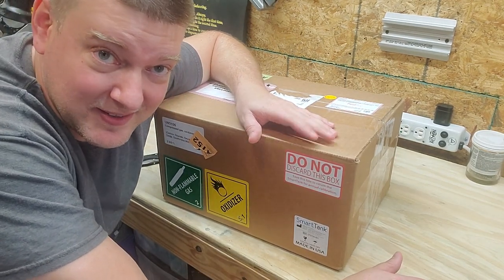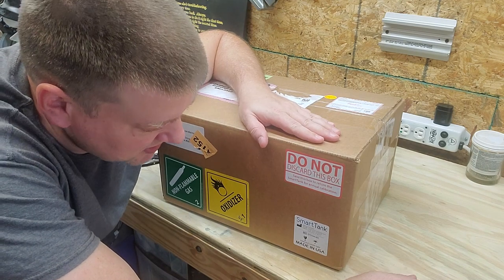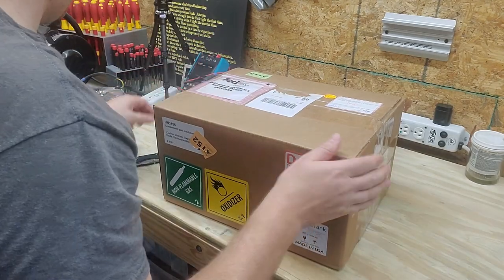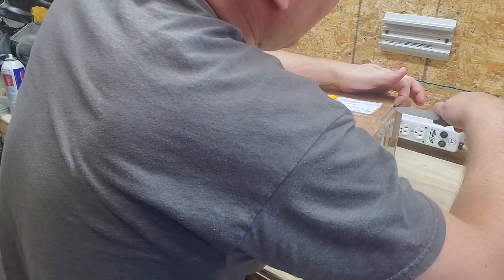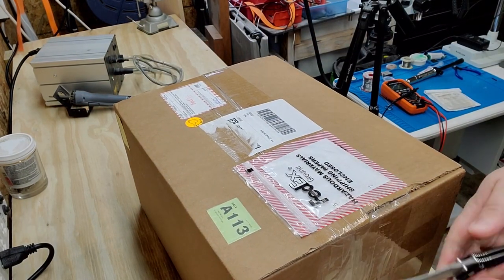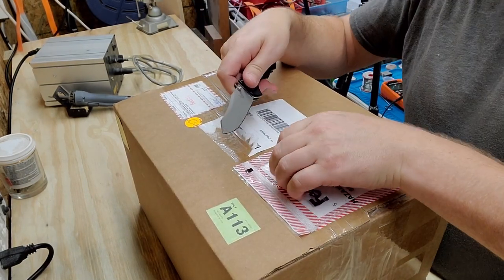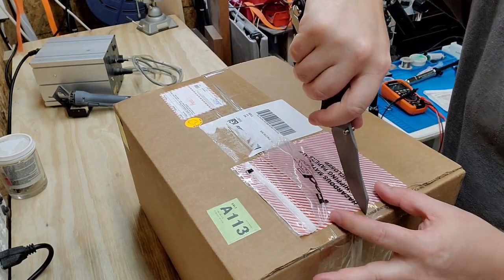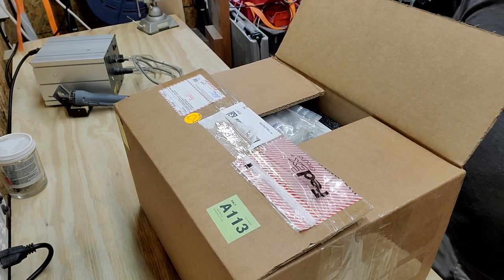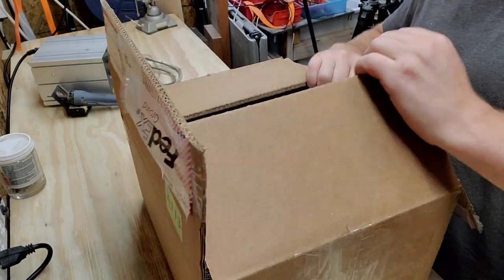So here it is today — it was sitting on my front porch after I had got through cutting the grass outside. Let's open up and see what's in the box: the Smart Tank Capnography Analyzer. First off, it is packaged rather well. It did ship with the compressed gases for the type of equipment that I'm going to be testing.